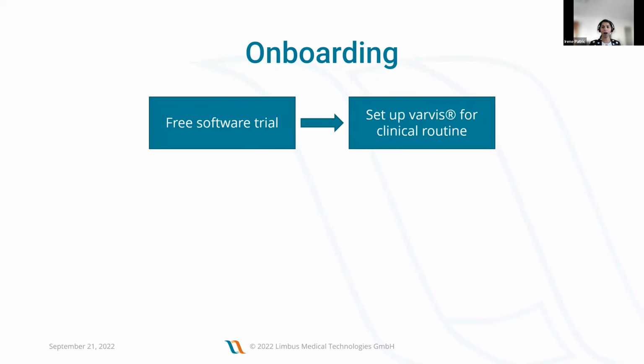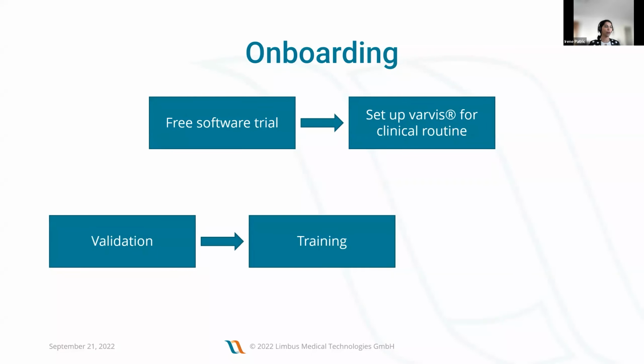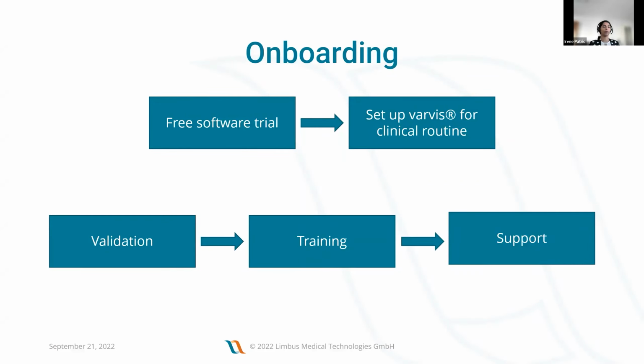And then once you are a customer, we are also able to help with validation, which I will be detailing a little later. And then we offer training. And then we also give you full access to the varvis Academy. And then, of course, we are there to support you throughout the process of setting up and also later when problems arise with the cases that you have, or at some technical aspects we are able to support.